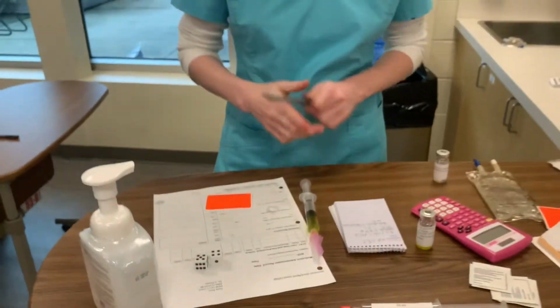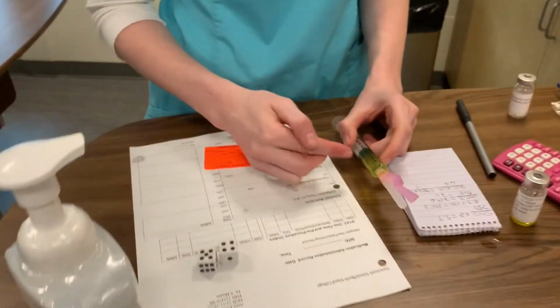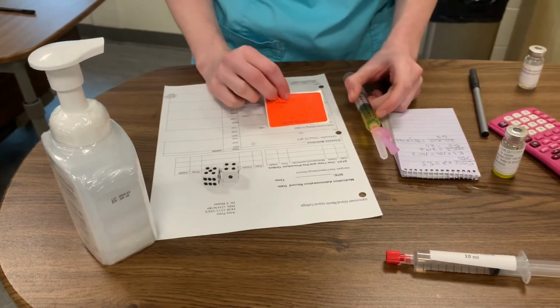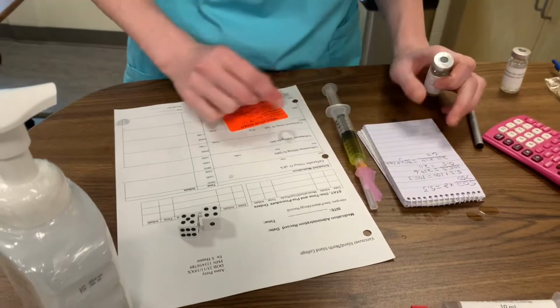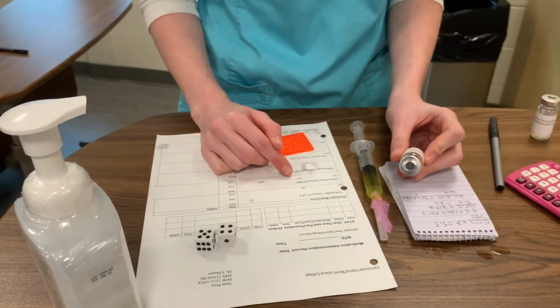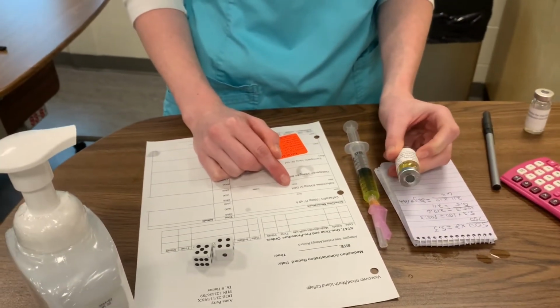Now I'm going to do my third check to check the dose against the vial a second time. So I have cefuroximine, 500 milligrams, for Anna Perry at 8 o'clock in the morning, prophylactic antibiotic via IV every 8 hours.